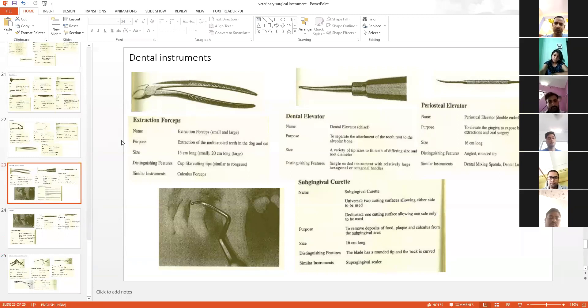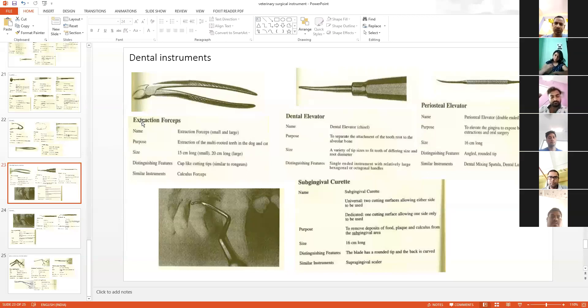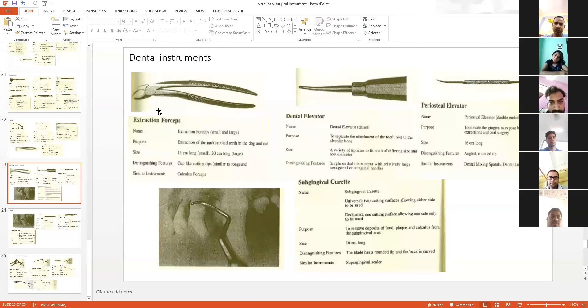These are some dental instruments. This is for extraction. If you need to extract a molar tooth, you see this is a very hard structure.